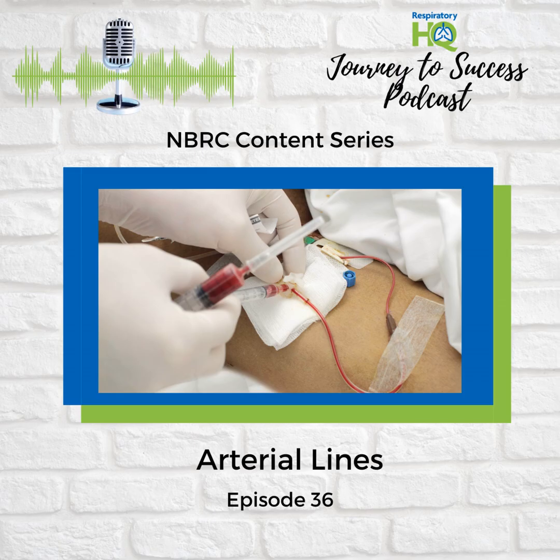Oh, no. That's where the blockage goes to the brain. That's when things can get really serious, could even lead to a stroke. That highlights how important it is to do this carefully. Absolutely. Proper technique is crucial, especially when flushing the line, to minimize that risk. And it's not just embolization we have to worry about. There's also the risk of damaging the artery itself, especially if it's a smaller one. So using a bigger artery is safer.